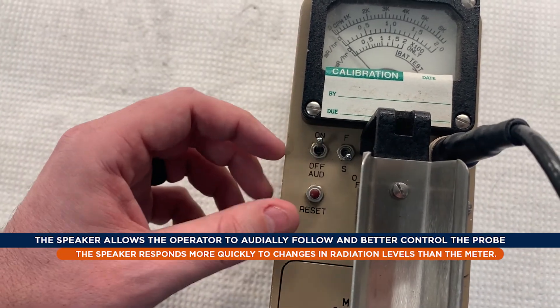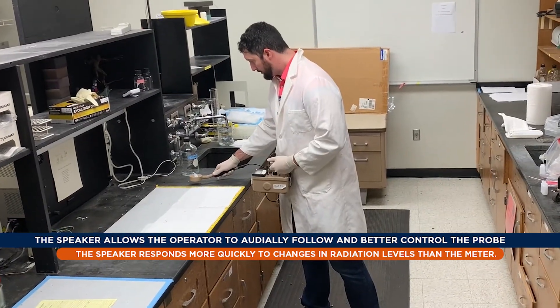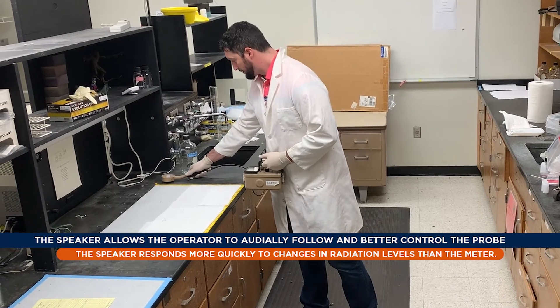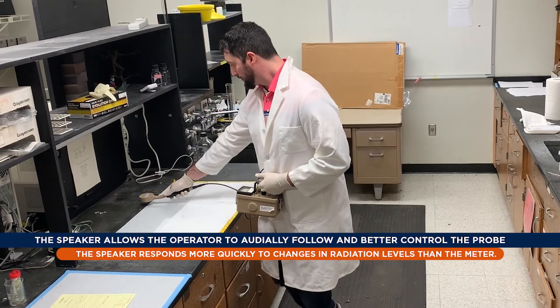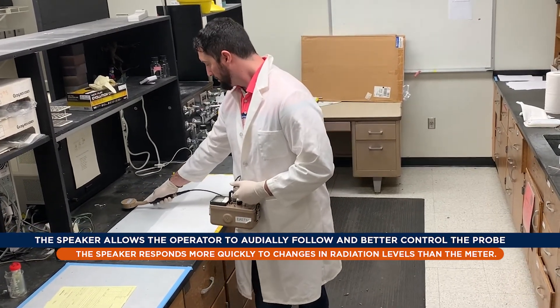Turn on the speaker because this allows the operator to audially follow and better control the position of the detector probe while monitoring. The speaker responds more quickly to changes in radiation levels than the meter.